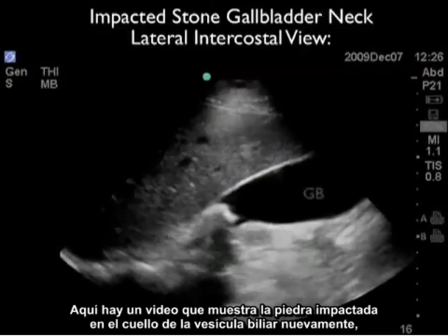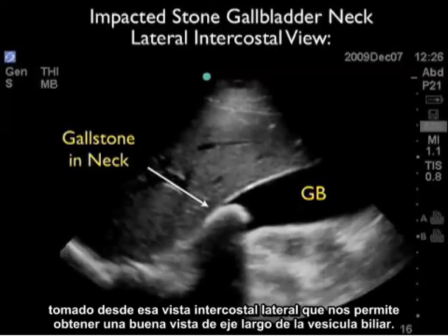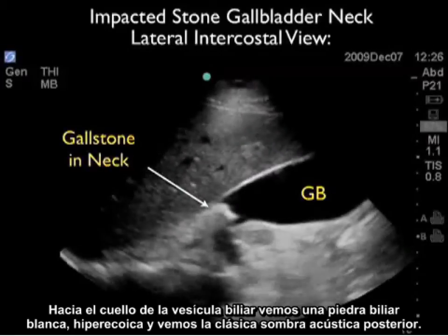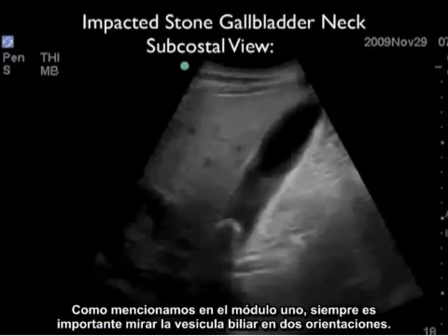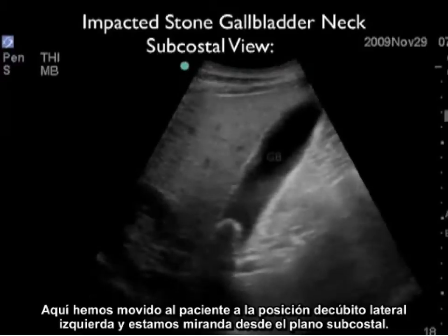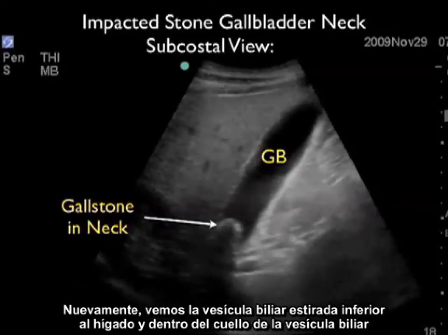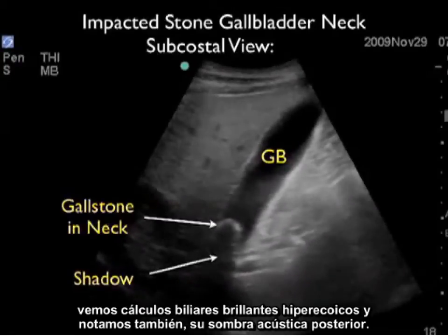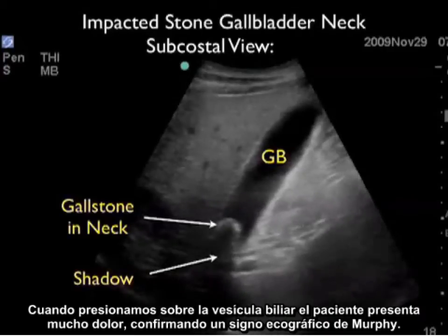Here's a video clip of an impacted stone at the gallbladder neck taken from the lateral intercostal view. We see the liver at the top and the gallbladder inferior to it. Towards the neck we see a white hyperechoic gallstone with classic posterior acoustic shadowing. As mentioned in module one, it's important to look at the gallbladder in two orientations. Moving the patient into the left lateral decubitus position and scanning from the subcostal plane, we again see the hyperechoic gallstone within the neck with posterior acoustic shadow. Pressing down on the gallbladder, the patient had a lot of pain, confirming a sonographic Murphy's sign.